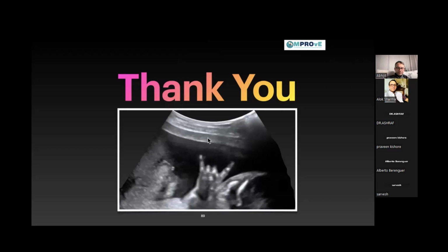So if you have gone through pattern recognition, it's absolutely mandatory that when you're doing a segment, if you're saying this with sliding, that you verify that using M mode, and that if you're worried there's no total sliding, that you look at it again. Sorry, Alok, you're breaking up. I couldn't get the whole question. So the question was, when would you use M mode? When do we use M mode?